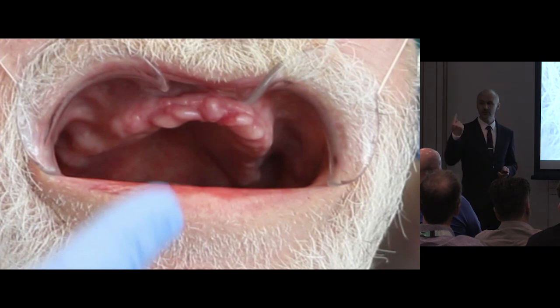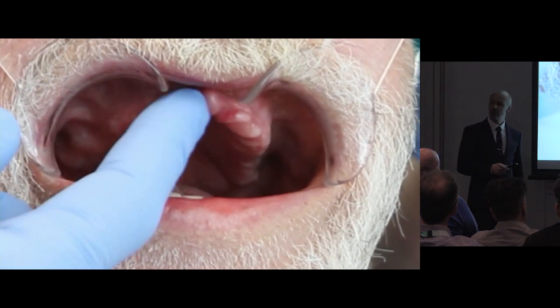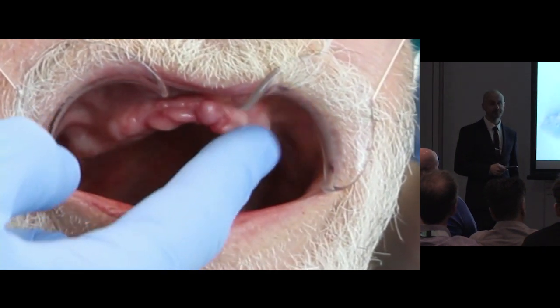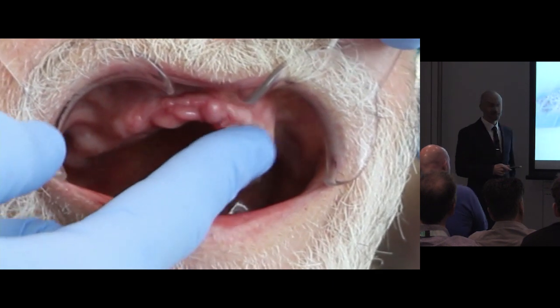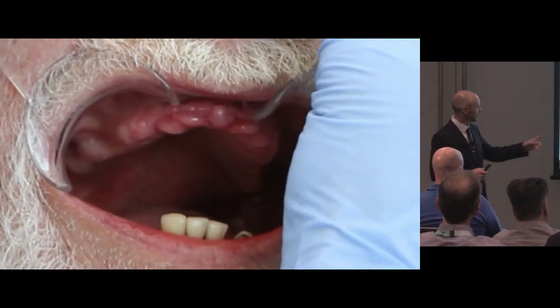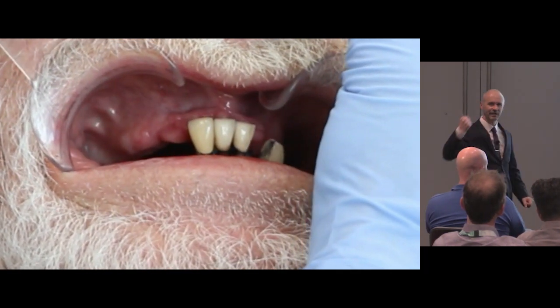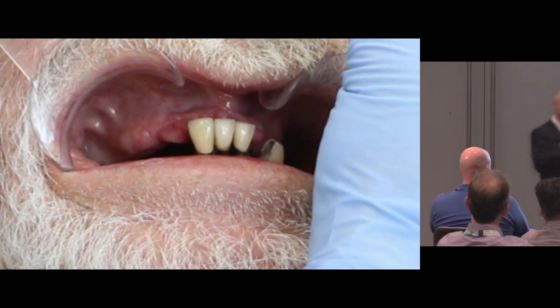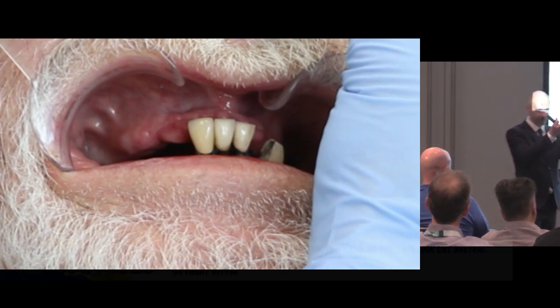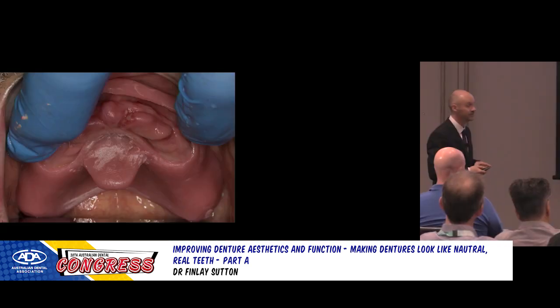Anyway, I'm going to talk about the upper first and then I'll move on to the lower. This is Bert again, with his flabby upper ridge. This is classic combination syndrome. His lower teeth have been, over the years, bashing on this upper full denture and resorbing the maxilla there and leaving this wobbly ridge here. So this is what we did for Bert.